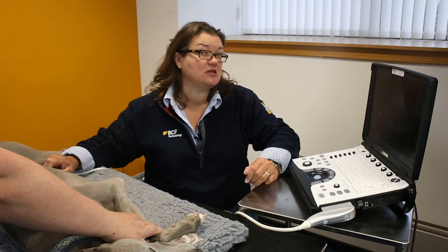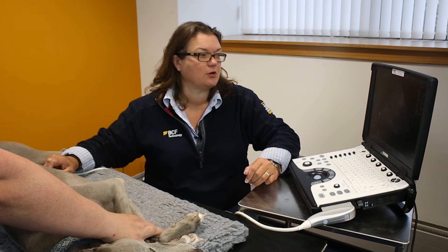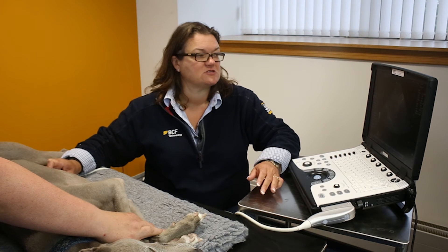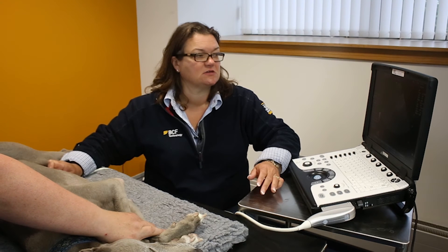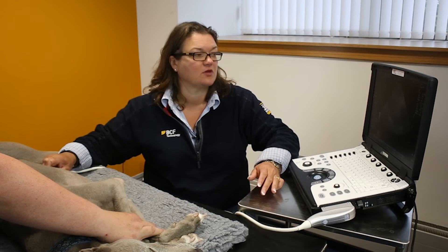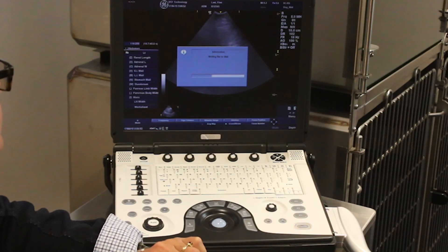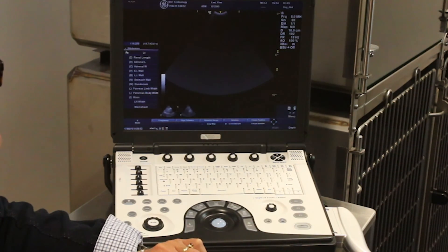Now if you wanted to save a cine loop, the procedure is very, very similar, but you just don't hit the freeze key. If I just scan through the liver like this and then want to save that, without hitting freeze, if I hit P1, you'll see it takes a little while because it's saving.